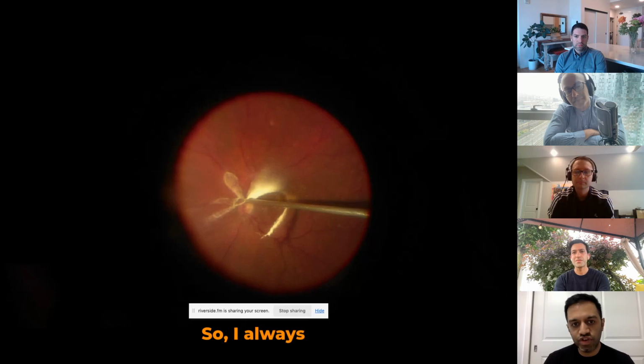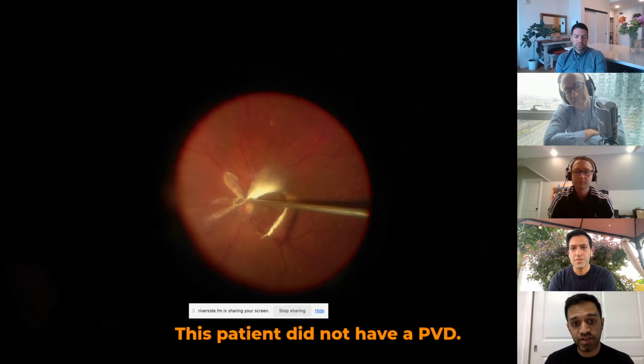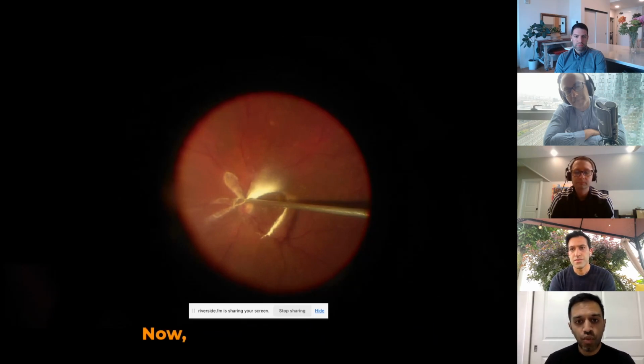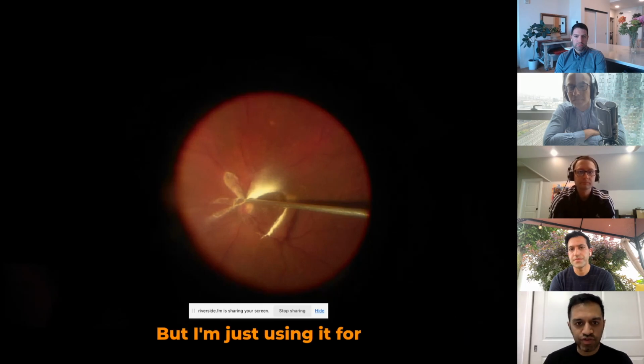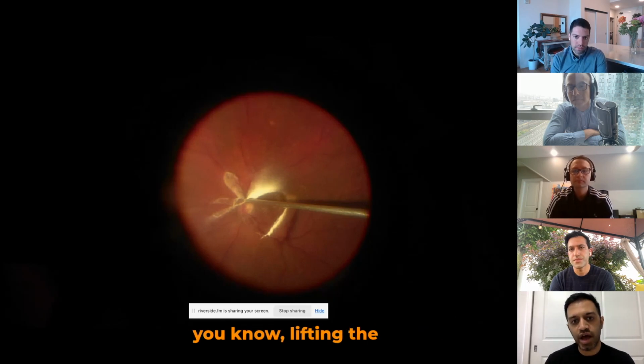So I always induce a PVD. This patient did not have a PVD. The hyaloid was attached. Now, one thing that's interesting about this is that it's generally considered suboptimal if there are steroids in the eye, if you're doing a diagnostic vitrectomy. But I'm just using it for the sake of lifting the hyaloid.